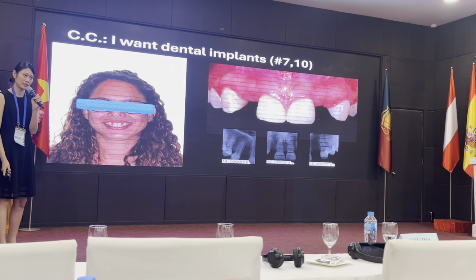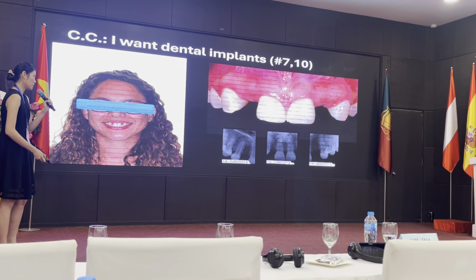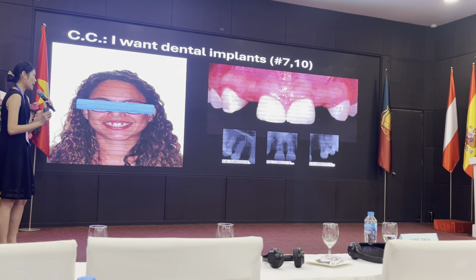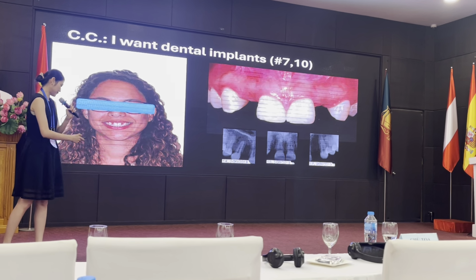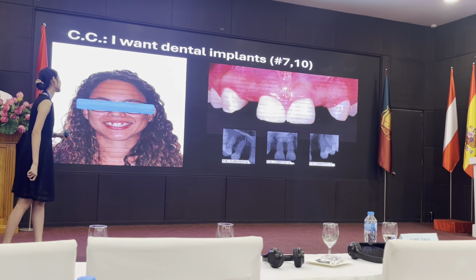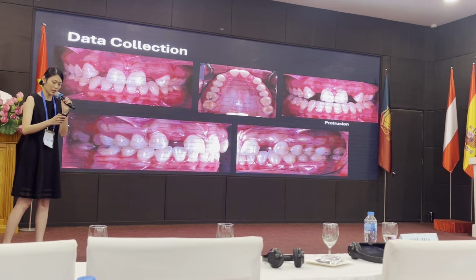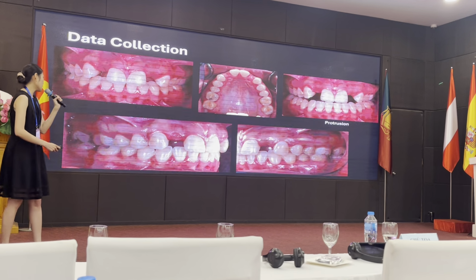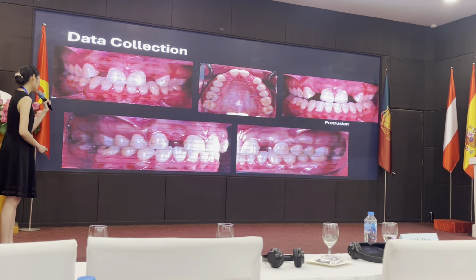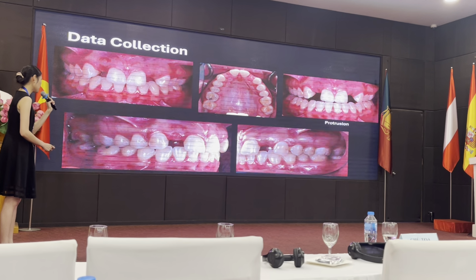Before I do any dental implant surgery, I still like to take some periapical films because that gives me the idea about how much bone I will have. Sometimes the CBCT doesn't show that well. So in the data collection process, I like to take the intraoral photos and evaluate the ridge, especially from buccal and occlusal view.